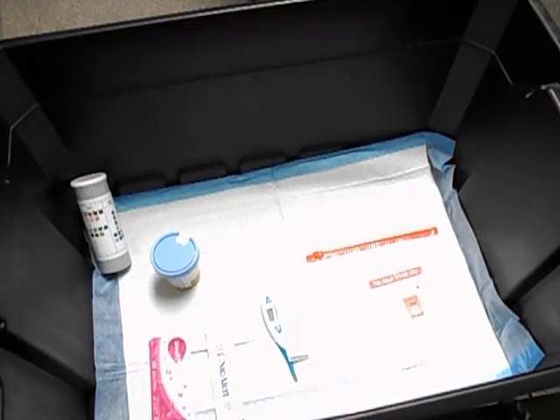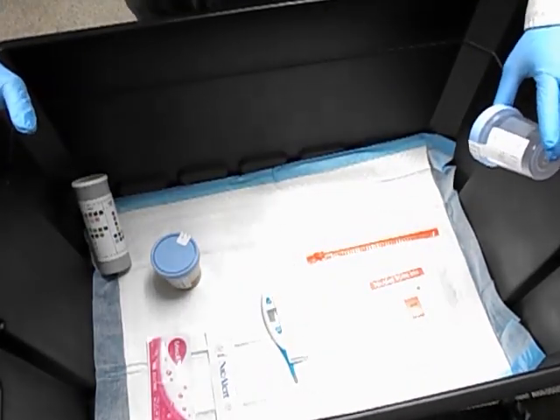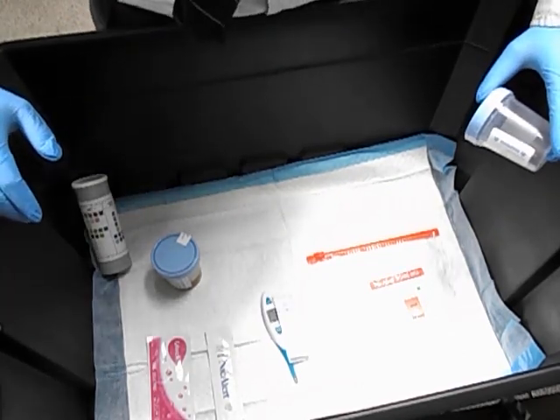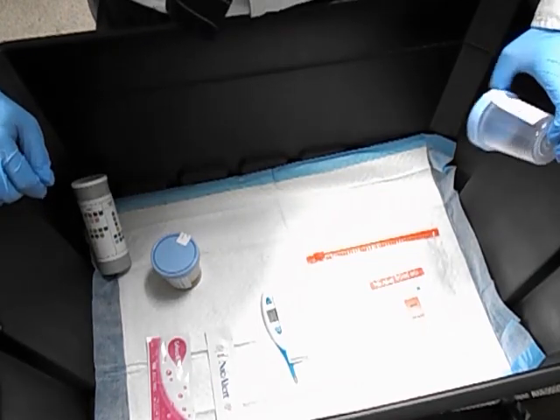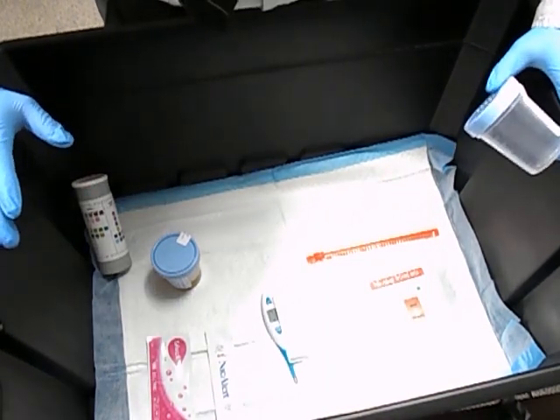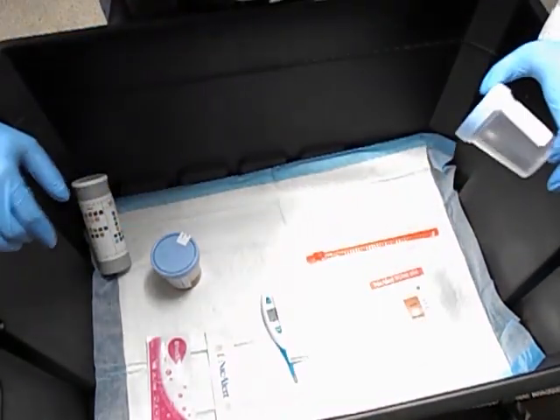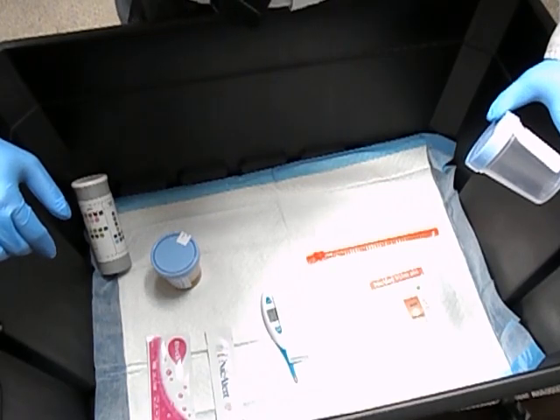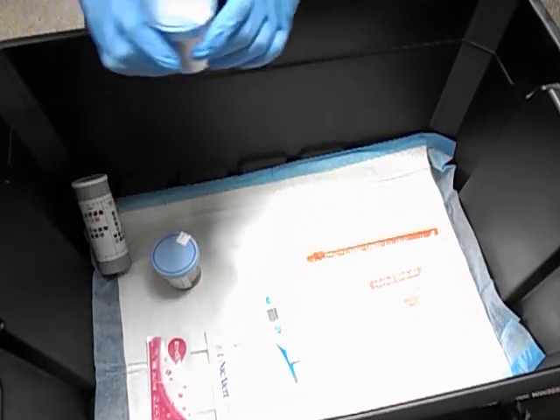Welcome to the second video. This is the video where I'm going to show you how to actually do the test. Something I didn't mention in the previous video is that when you set up the box before the patient comes in, you can do it with gloves on or not — whatever you're comfortable with.